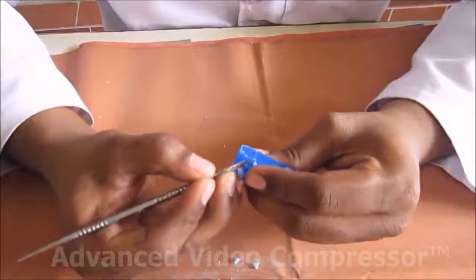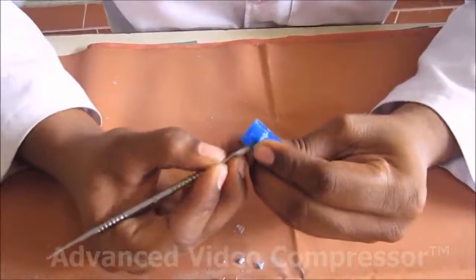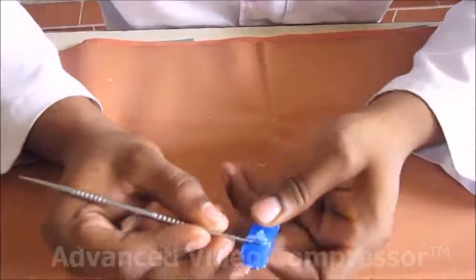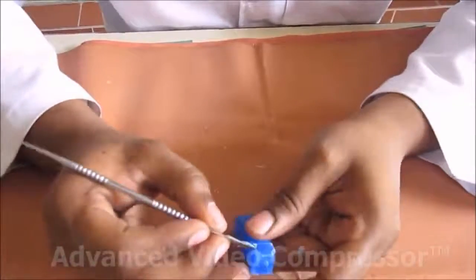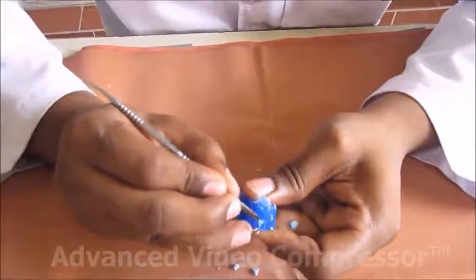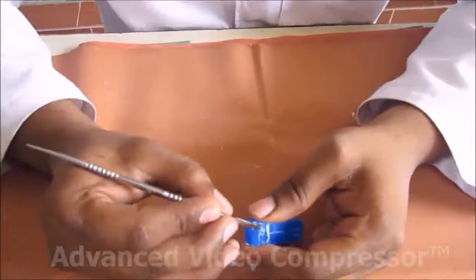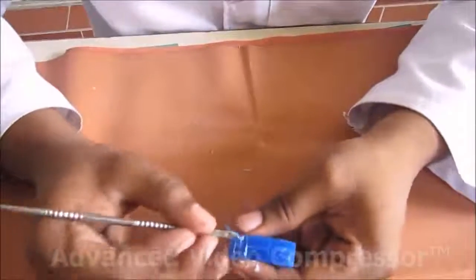The height of contour on the buccal side is in the gingival third. On the lingual side, it is on middle third. If you are carving this tooth for the first time, I would recommend you to keep the outlines of the crown slightly big. The excess wax can always be removed later. The shape of crown now resembles a hexagon.